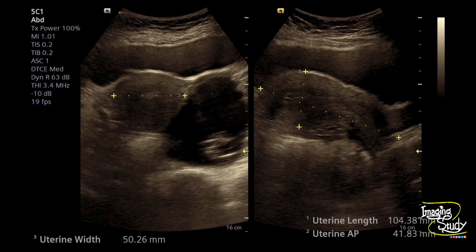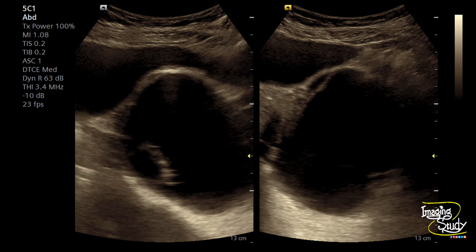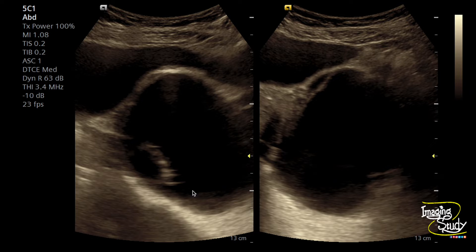Here's the measurement of the uterus — it is slightly elongated but not bulky. Here's the left adnexa where you can see a cystic lesion that appears anechoic except for this echogenic component. Now we want to evaluate it with transvaginal ultrasound.